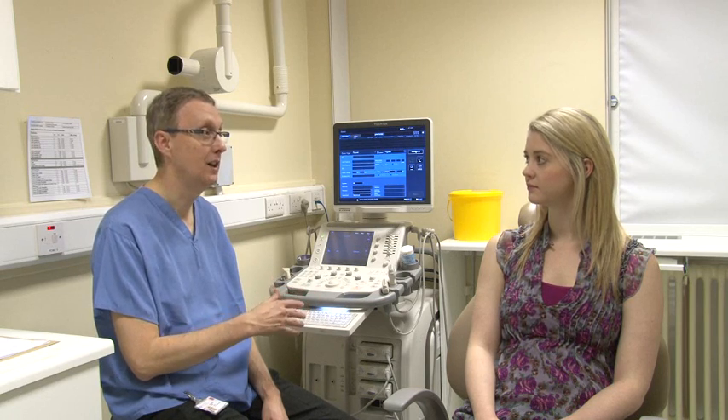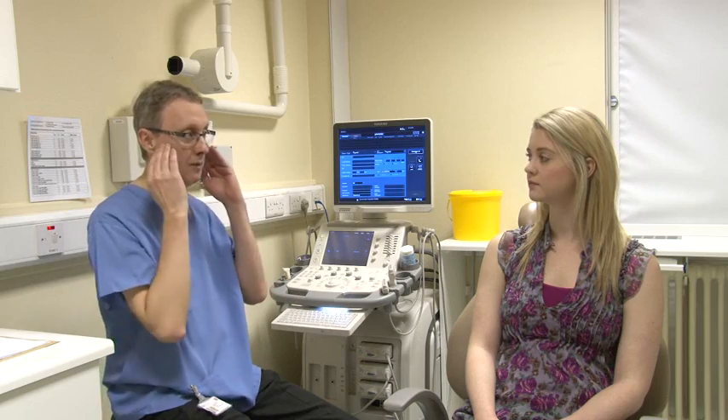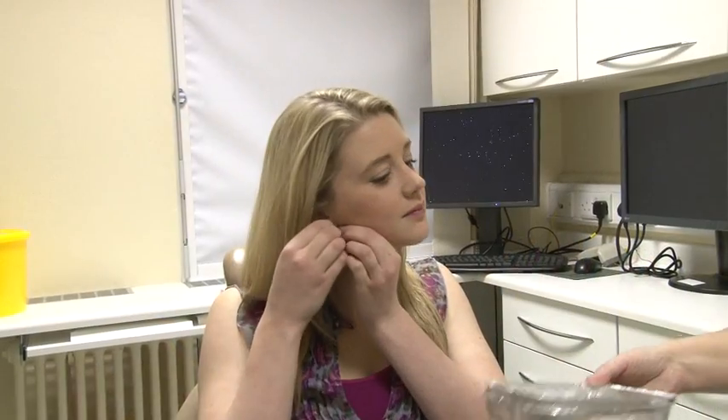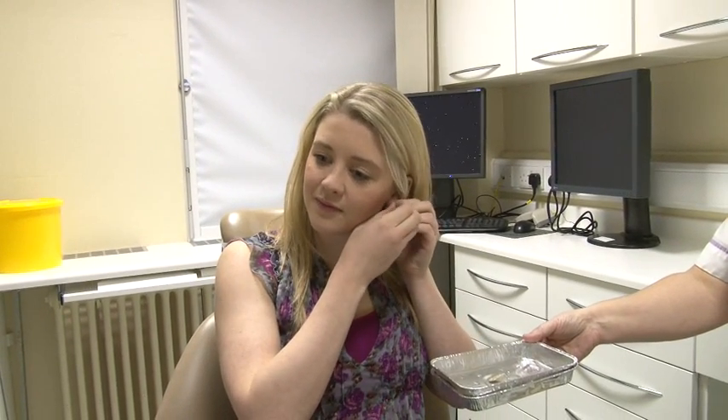What will happen is lying back flat in the chair, darkening the room so you can see the screen properly, and putting jelly on your neck on both sides and having a look around. If possible, try to avoid wearing high neck clothing and jewellery such as necklaces or large earrings.